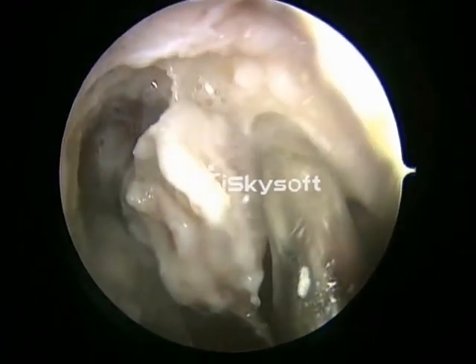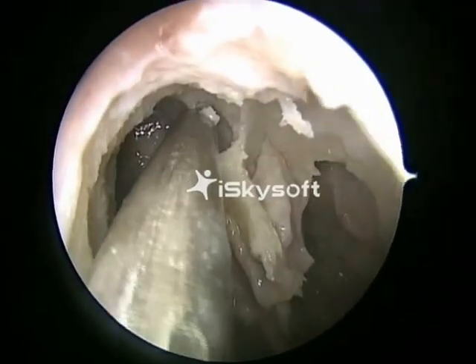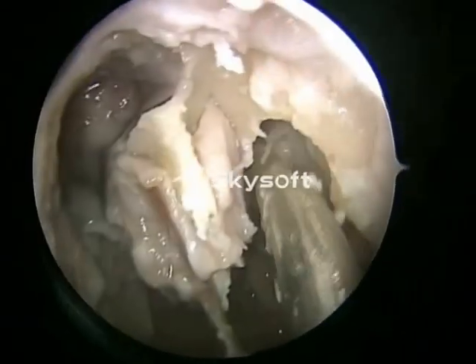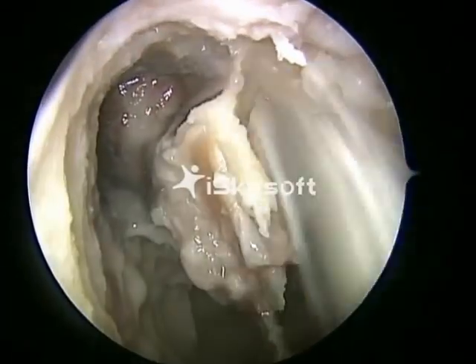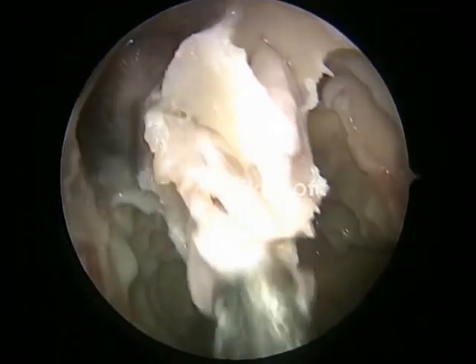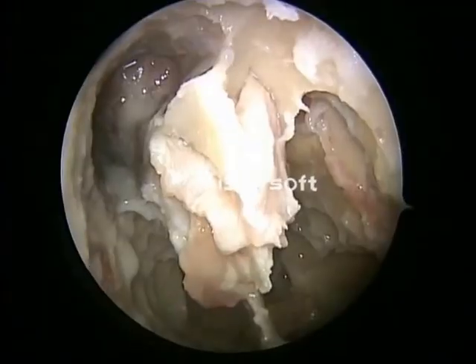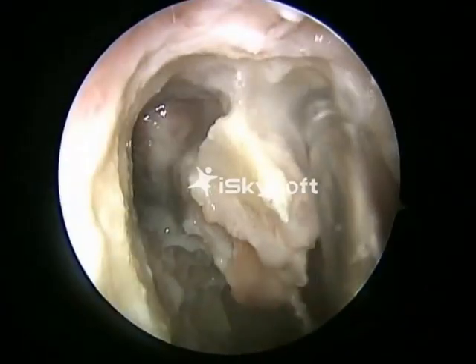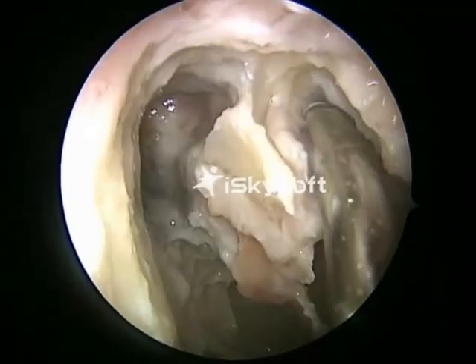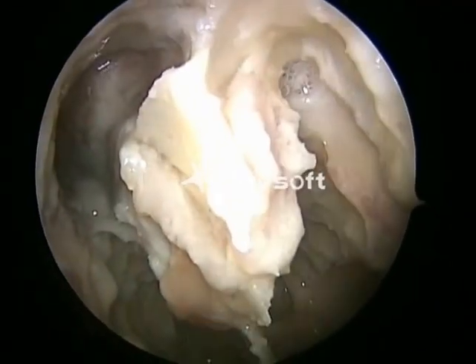The lateral limit of dissection is the skin just superior to the lacrimal sac fossa. That's the lateral limit of dissection. The ultimate size of the opening would be 18 by 24 millimeters.